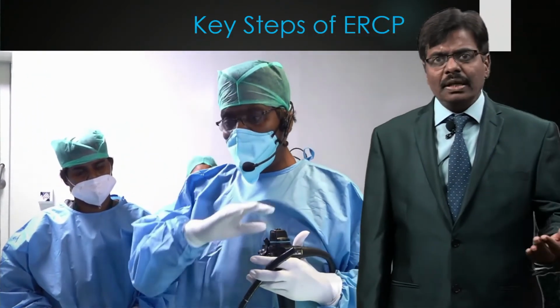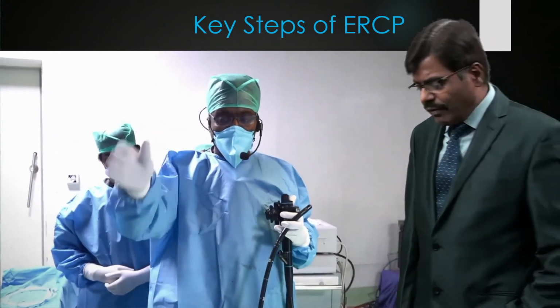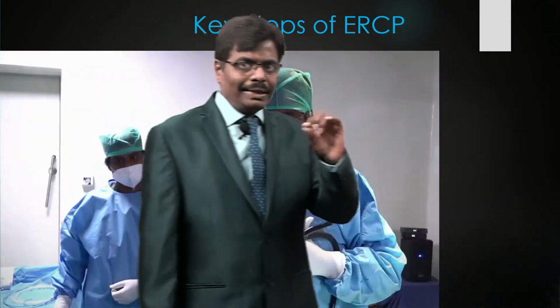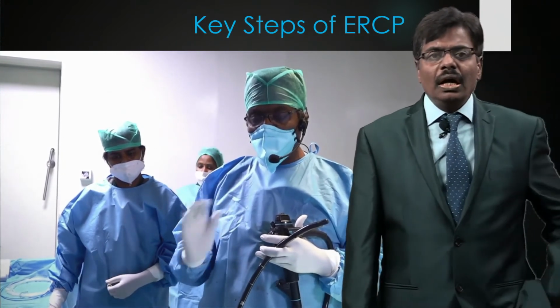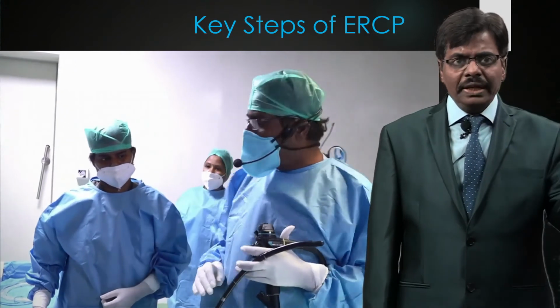If it is a pediatric group or if you want a smaller scope, especially when you have a pyloric stricture, we have another scope which has a 3.2 millimeter access channel. So depending upon what you need, you choose and then you proceed, and you tell the staff, and you get an idea where they all are.